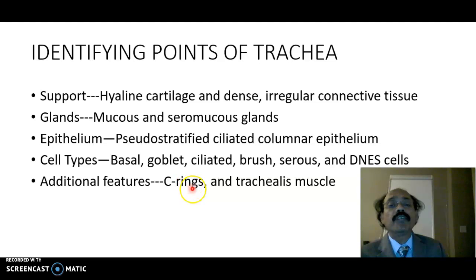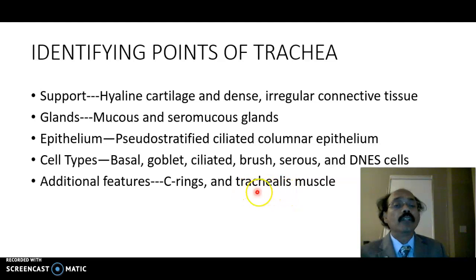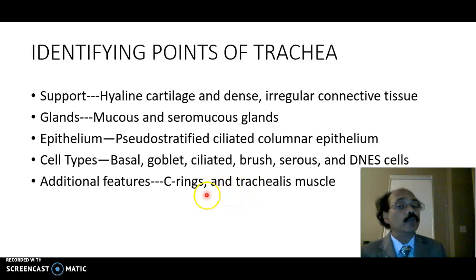The C-rings are composed of hyaline cartilage and the trachealis muscle. The trachealis muscle is a smooth muscle — each muscle cell looks like a spindle with a nucleus inside it. It is innervated by the recurrent laryngeal nerve, and it connects the two ends of the C-shaped hyaline cartilage rings.